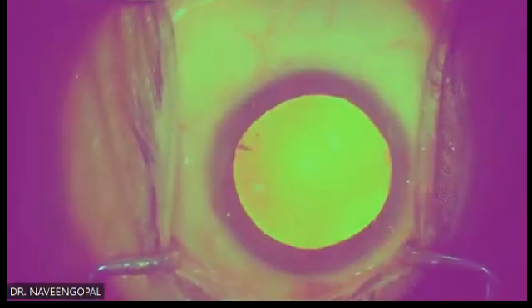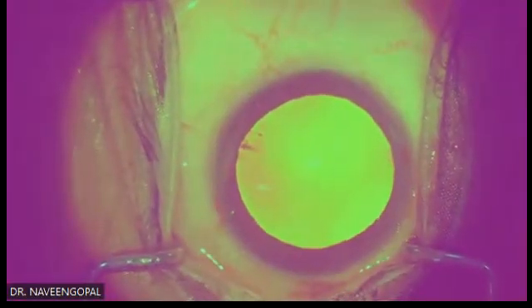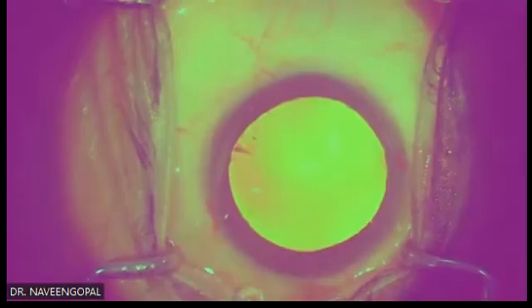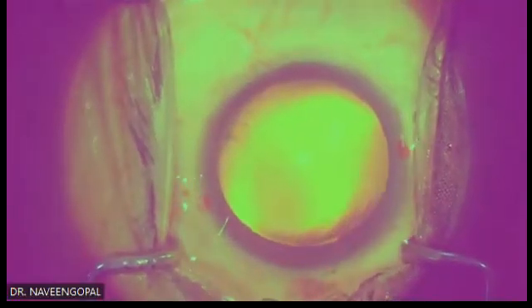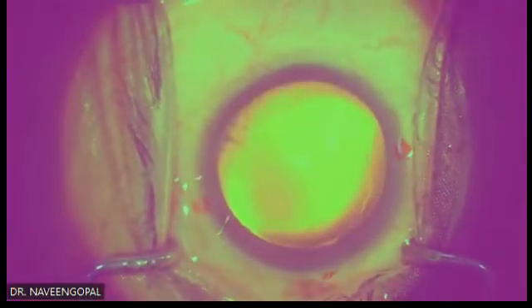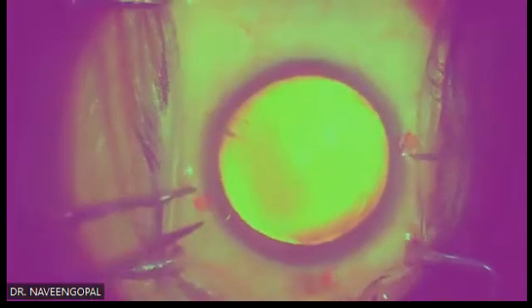From now on, you will not feel anything. Okay? Relax, ma. See, as you can see, the red glow. It's a very soft cataract. Relax, ma. Relax.